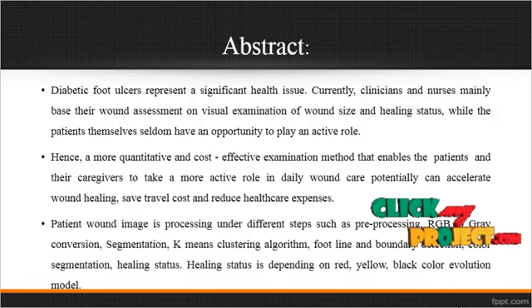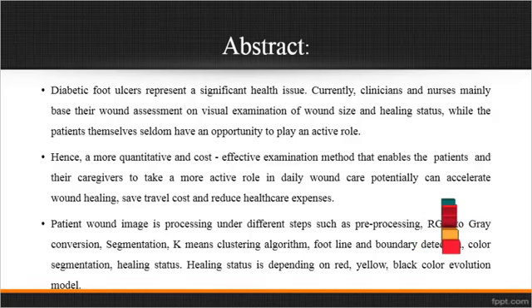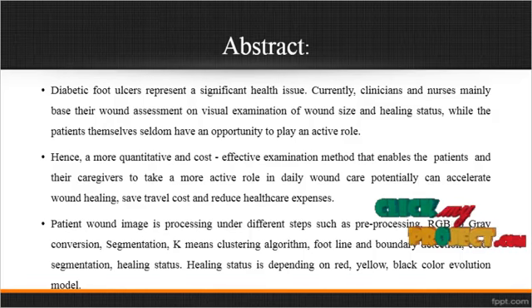Here, a more quantitative and cost-effective examination method that enables patients and their caregivers to take a more active role in daily wound care can potentially accelerate wound healing, save travel cost, and reduce healthcare expenses.